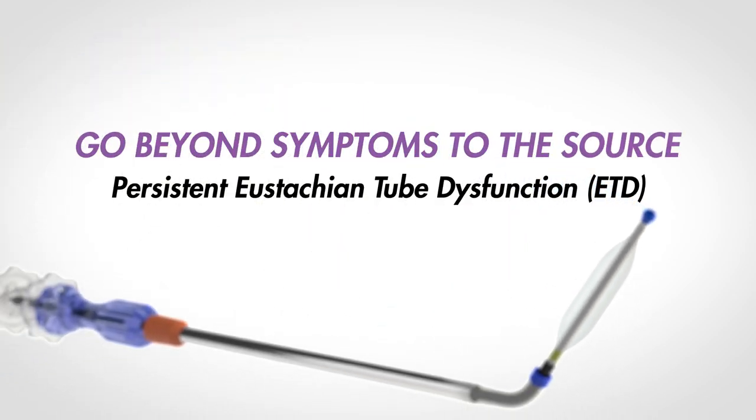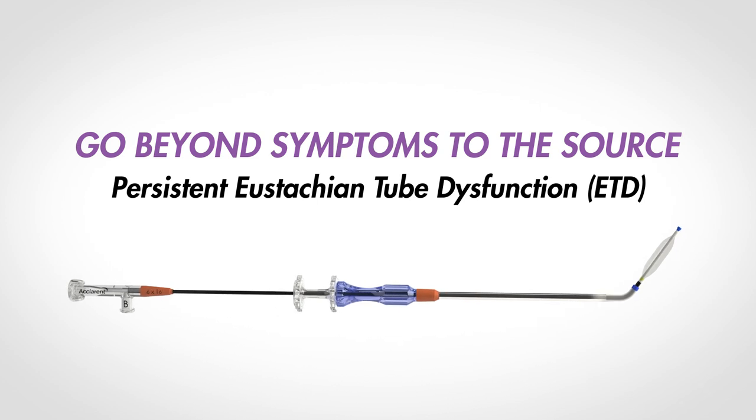Aclaret Era goes beyond symptoms to the source and is proven safe and effective for treatment of persistent eustachian tube dysfunction.